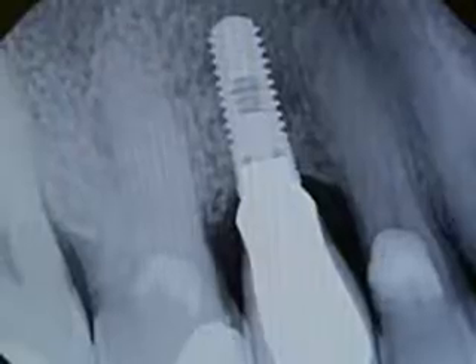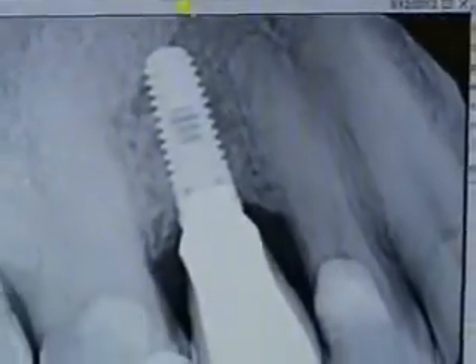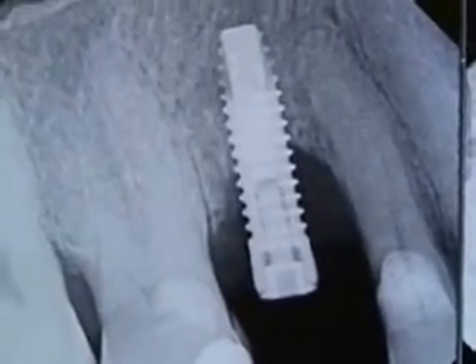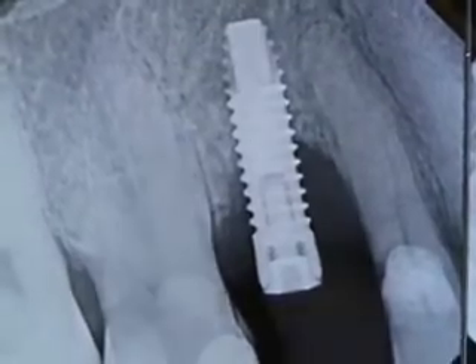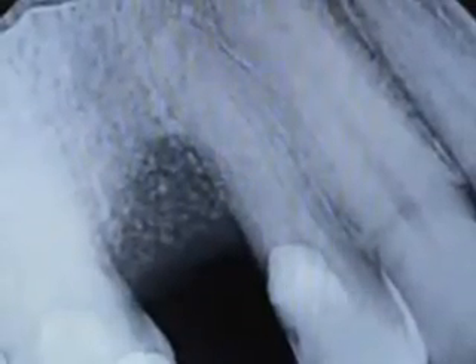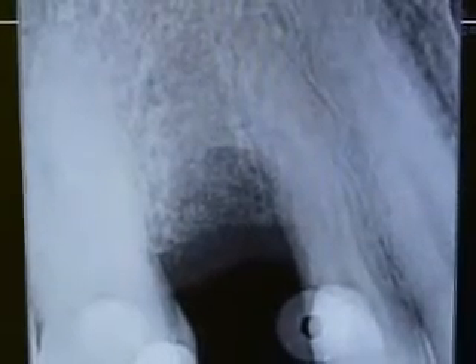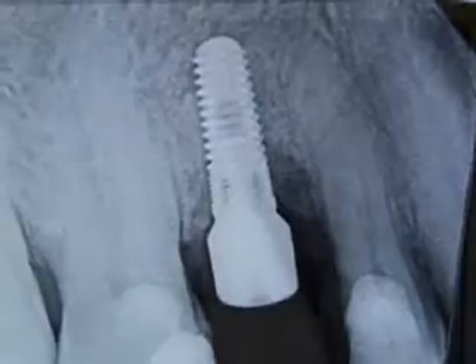Here's our x-ray today after just over two years, and here's our x-ray from eight months ago. This is our original x-ray — the failed implant, immediate implant, and provisional. The extraction and bone grafting that we did. Here's the healing of the extraction of the implant and bone grafting prior to implant placement. Here's our replaced implant.